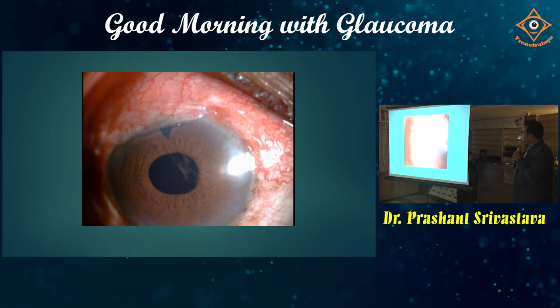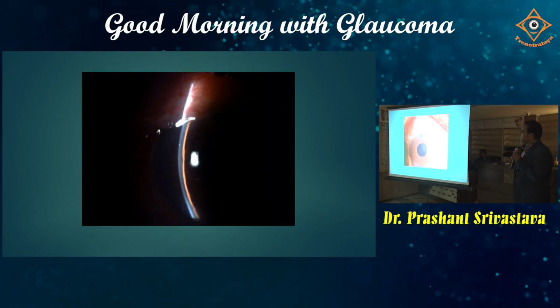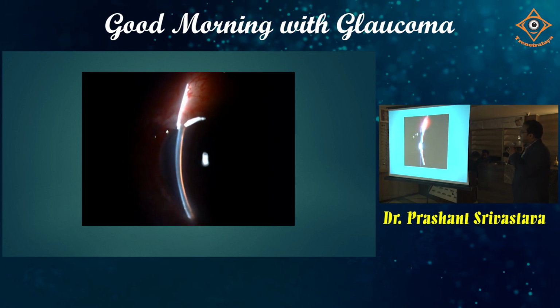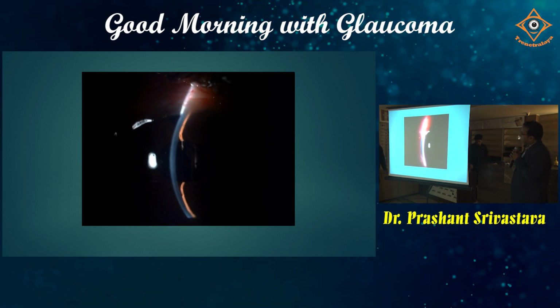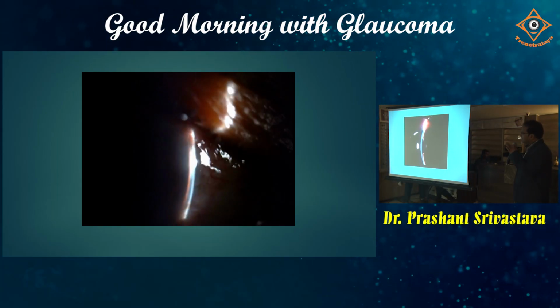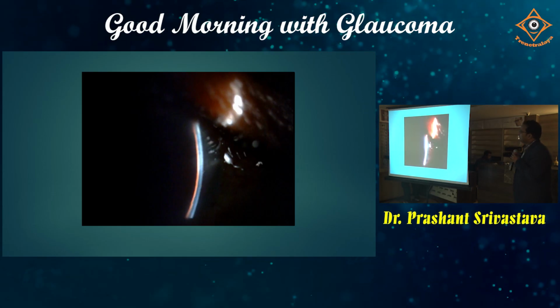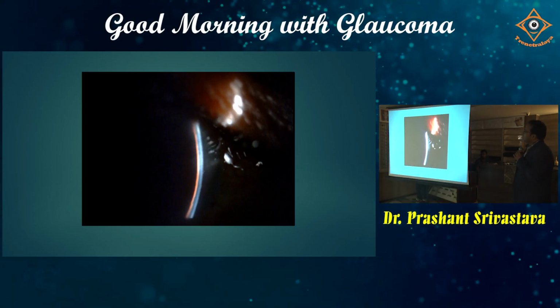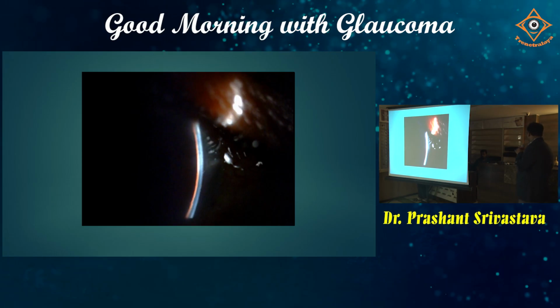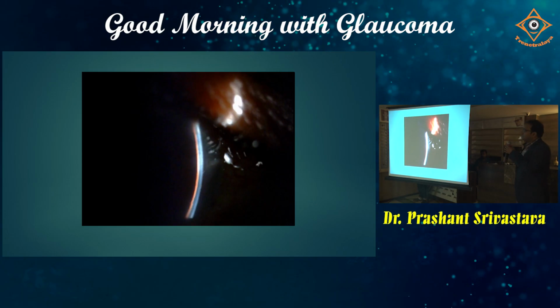And IOP was low. Generally, we can use a pressure bandage and give a cycloplegic. This is how the slit lamp video looked. The chamber was very shallow, almost touching, very close to the cornea. There was no choroidal detachment. So we give a strong cycloplegic and then observe the patient. This is a case of an over-filtering bleb. I was very aggressive, removing the suture early.